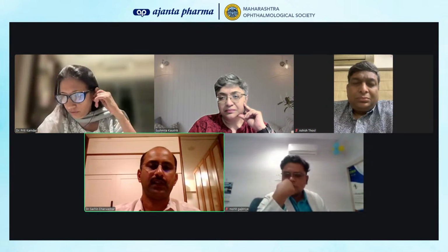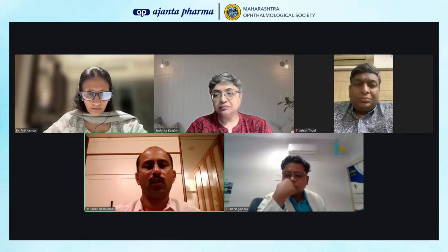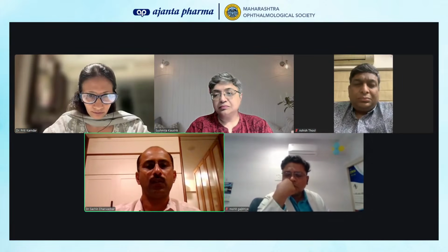Yeah, so what happens is you do get artifacts in a trifocal in OCT. So what, as Dr. Sushmita has correctly said, I would just put it in the terms of physics. You do not put any aberration inducing optics in an eye which is already having contrast compromise. Very simple. Do not induce aberrations, because those aberrations will affect even your examination of the disc.